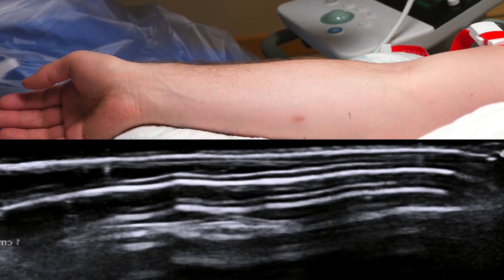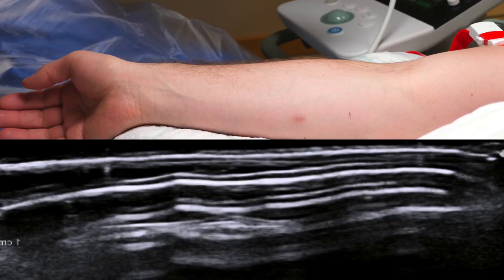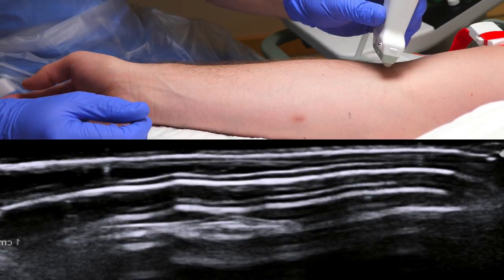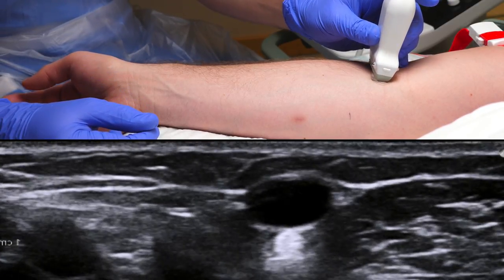Proceed by finding a comfortable working position and placing the ultrasound machine within your line of sight. Now place the linear probe so you get a cross-sectional picture of the arm. Confirm that the target vessel is actually a vein.